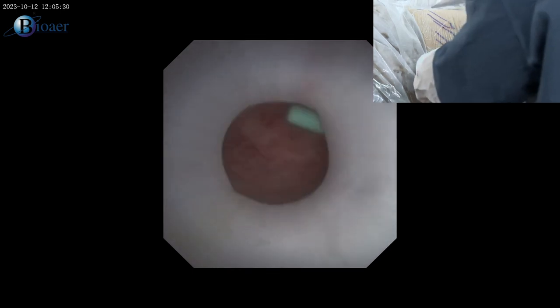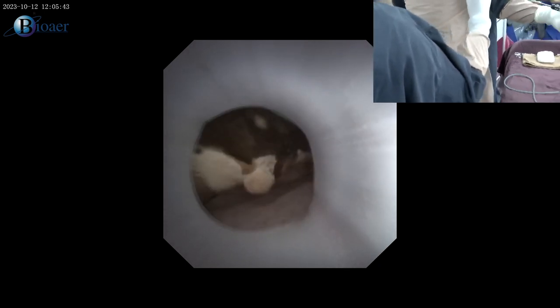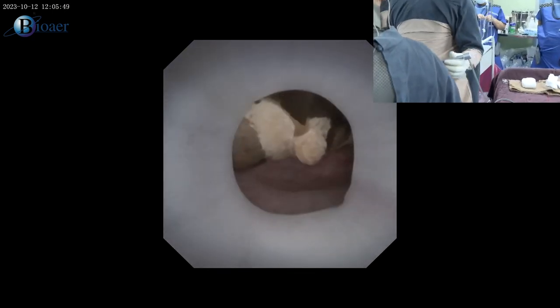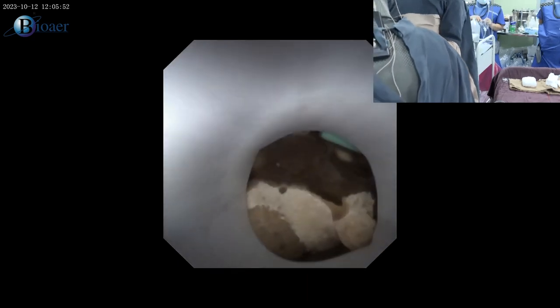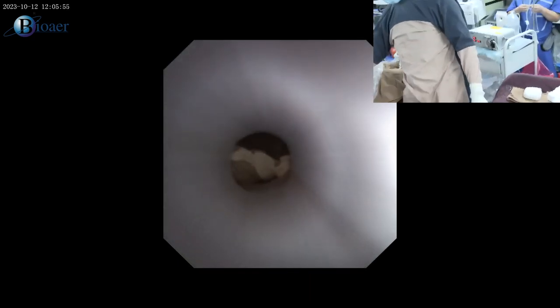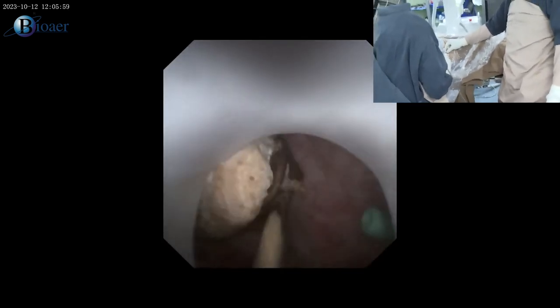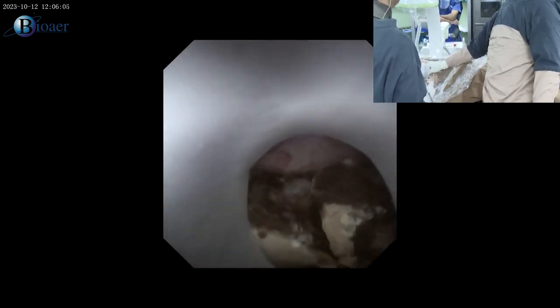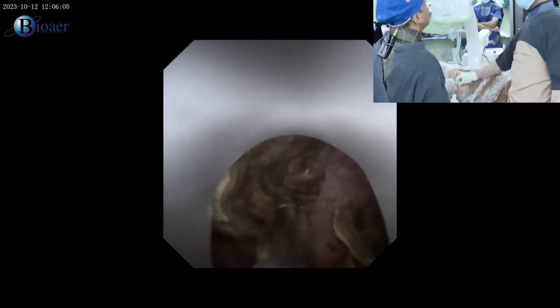Now we start with the lithoclast. I don't have TFL or 100-watt holmium laser. I use a simple locally available 1.4 mm mini lithoclast, which is far more effective than any other energy source for these stones. I will fragment these stones into multiple small pieces — you can have a good endo view as I do this.